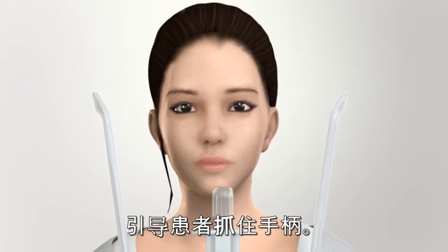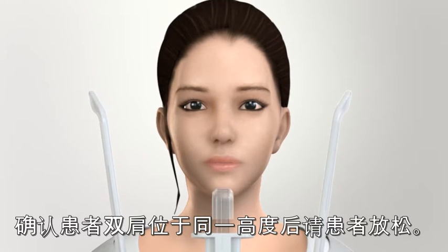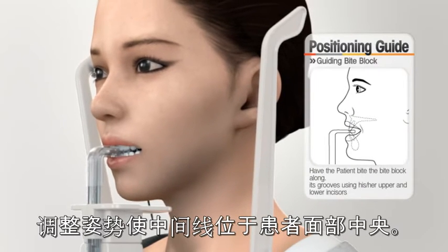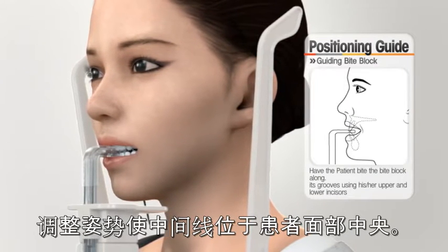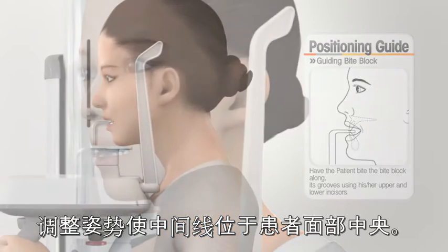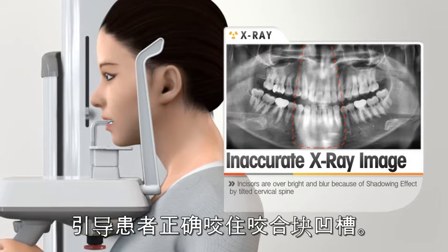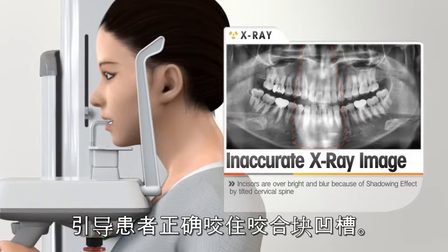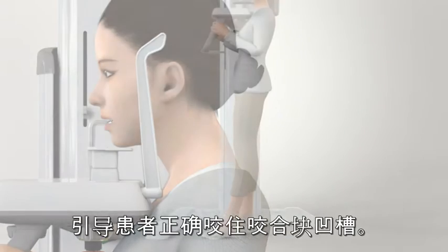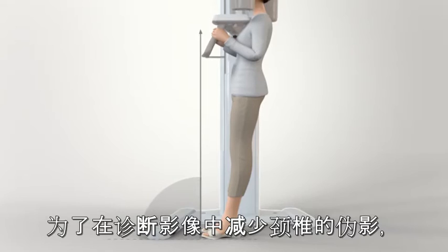Confirm the patient's right and left shoulders are parallel and lead the patient to relax. Ask the patient to bite the bite block. The incisor edge of the upper and lower teeth must be placed on the groove of the bite block. The operator should position the patient according to the following process to minimize the shadowing effect of the spine and stretch the spinal image. Ask the patient to step forward like the screen.